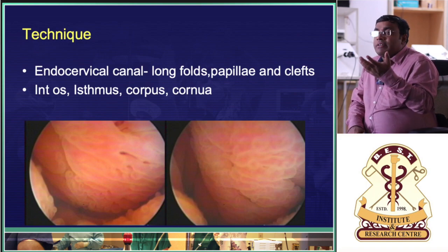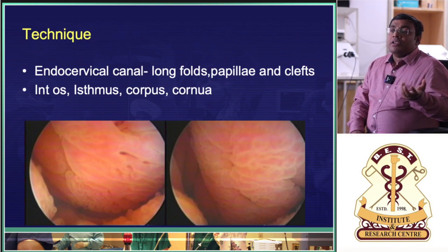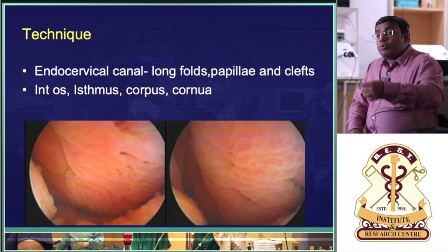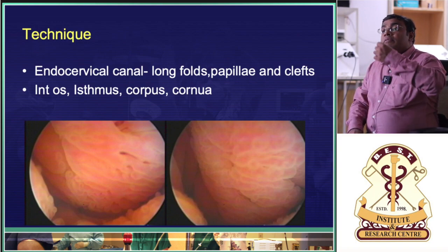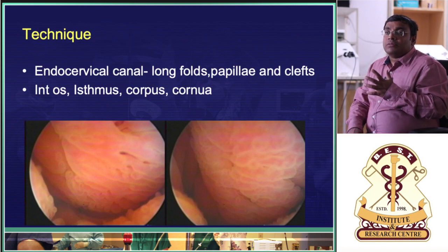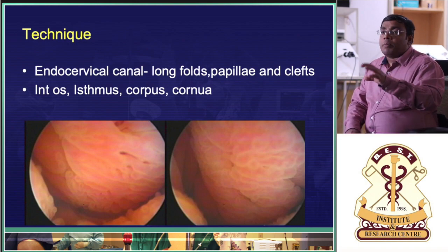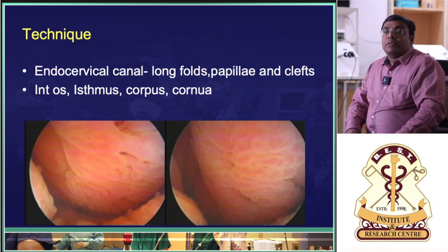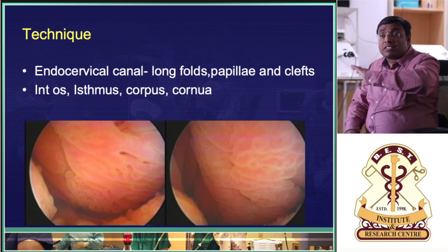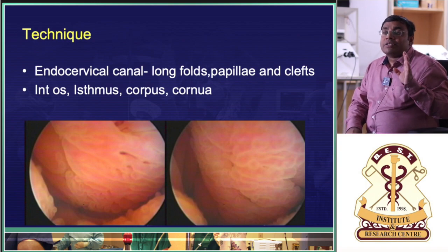See, when I go to IVF centers where they are doing hysteroscopy, if you see IVF specialists who do a hysteroscopy, they will always catch hold of the cervix, they will always dilate the cervix, they will always pass the sound before they do a diagnostic also. Forget about operative, for everything they do. We don't touch the cervix at all. Then when you do vaginoscopy, everything by vaginoscopy.